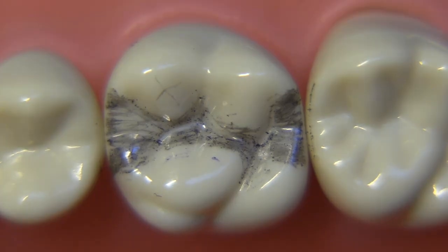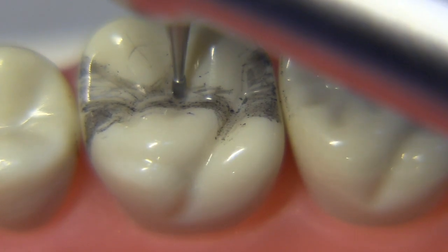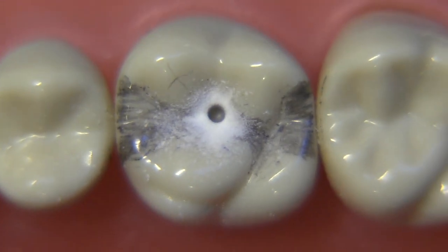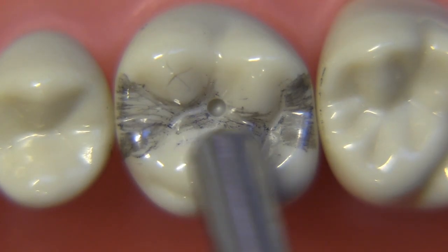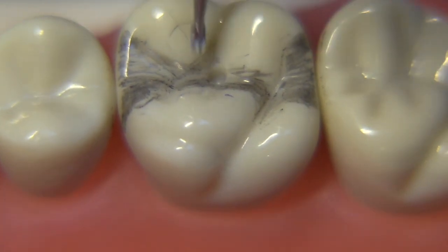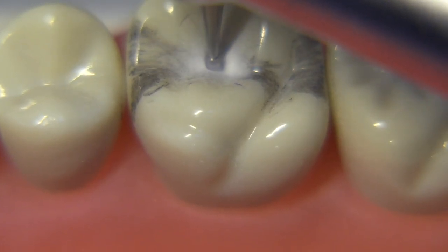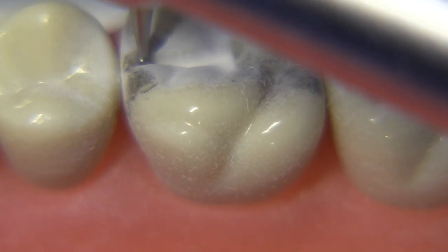Let's get started with the occlusal preparation. For this step we're going to start with the 330 bur, which measures 1.6 millimeters, and this will give us a good idea of our depth. This is just a punch cut that we'll place in the central fossa area, and it should be 1.5 millimeters deep. It's pretty important to try to get the bur all the way to full depth rather than playing around with a very conservative preparation — you end up making it wider as you go deeper.